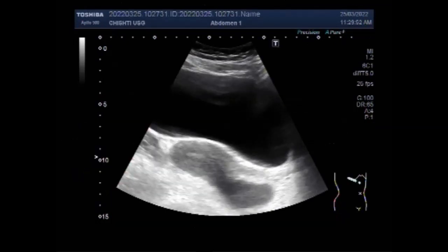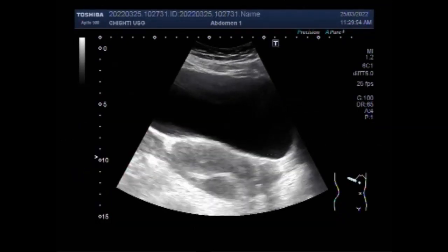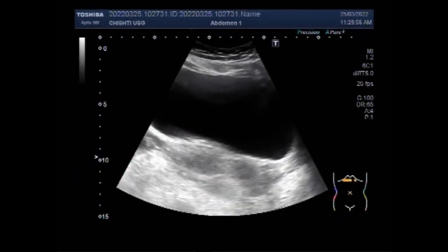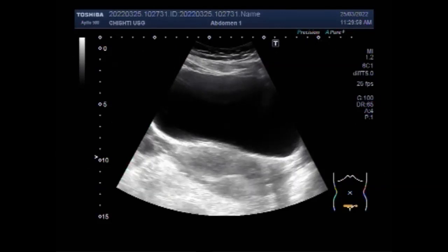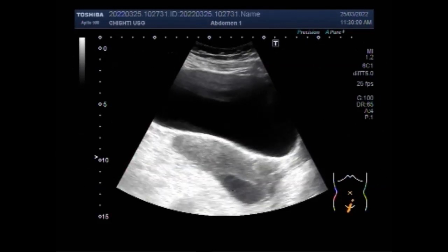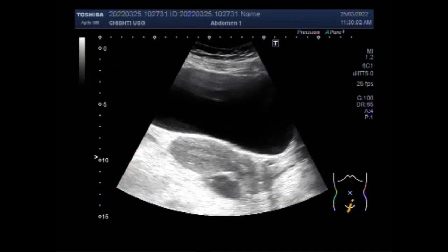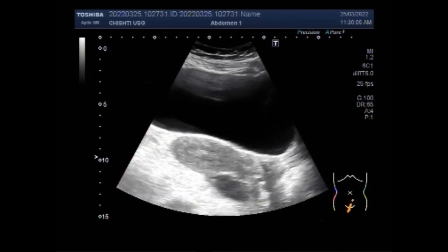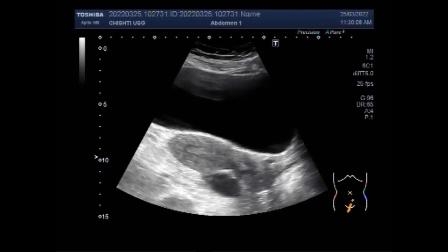This ultrasound video shows an extra-uterine pregnancy — ectopic pregnancy in the right ovary. This is an ovarian pregnancy with a fetus having fetal demise.